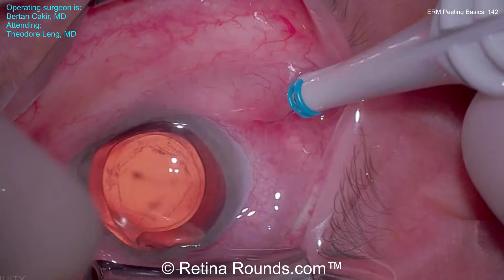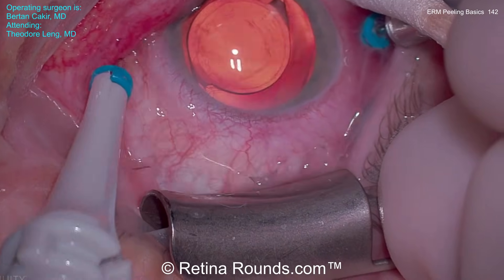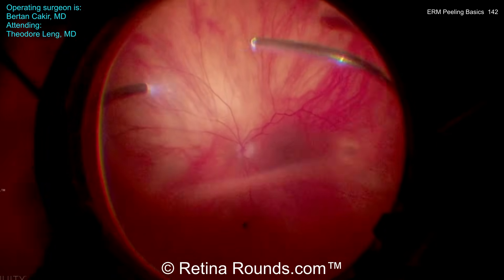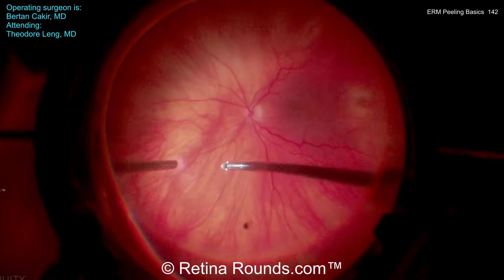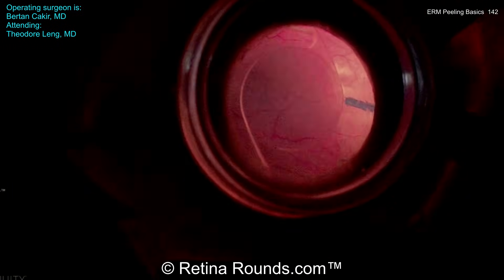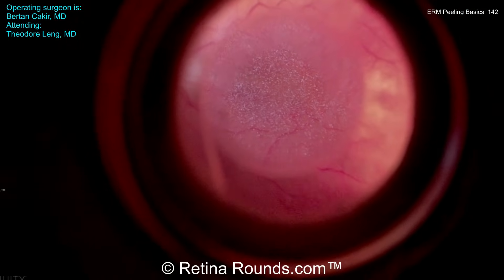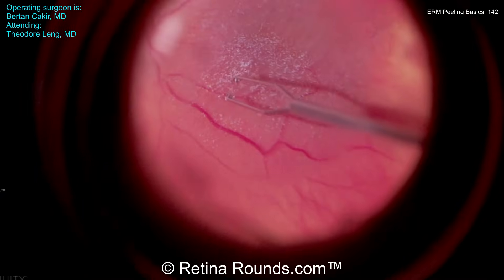In the case, trocars are first being placed. This is a three-port pars plana vitrectomy. You can see that the patient is pseudophagic. Once those trocars are put in place, Dr. Chakir introduces the light pipe and the vitreous cutter to perform a core vitrectomy. This patient already has a PVD, although triamcinolone will be used later just to confirm its presence. For the sake of time, we're skipping the peripheral shave, but it is important to perform a good peripheral shave and careful scleral-depressed examination since retinal breaks can be identified and should be treated.